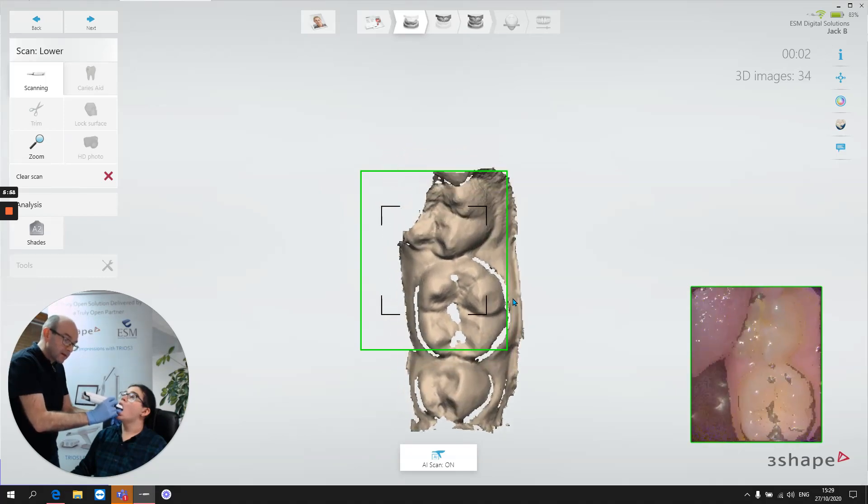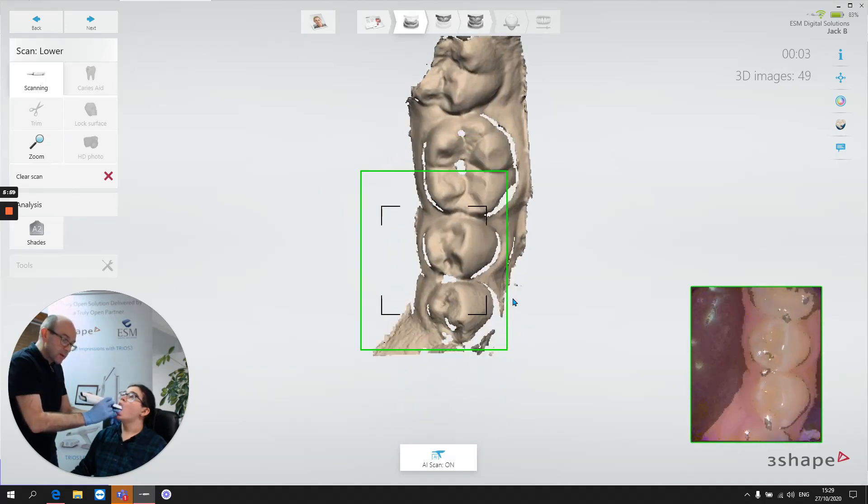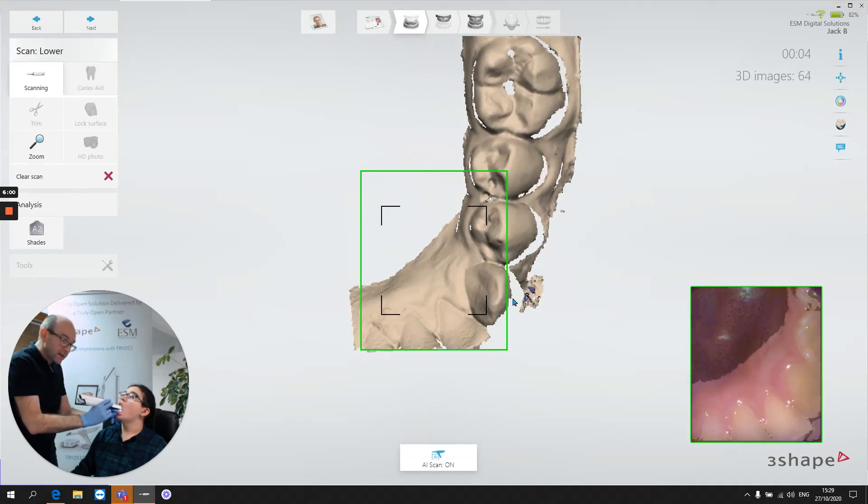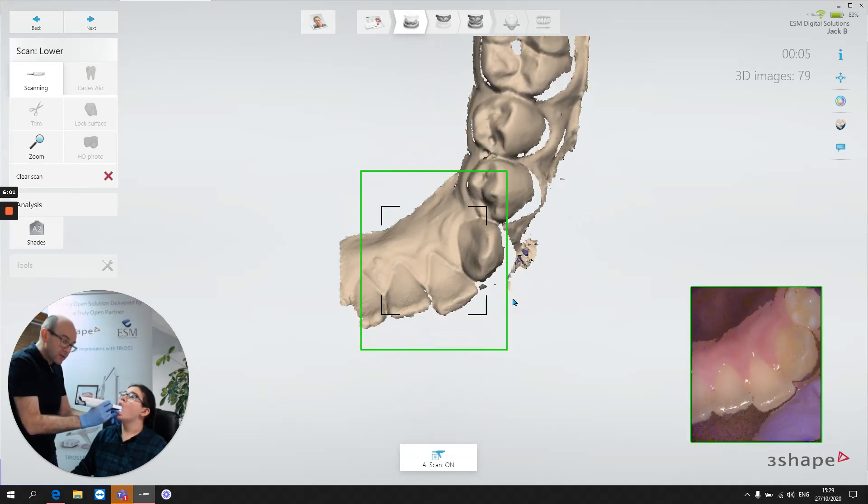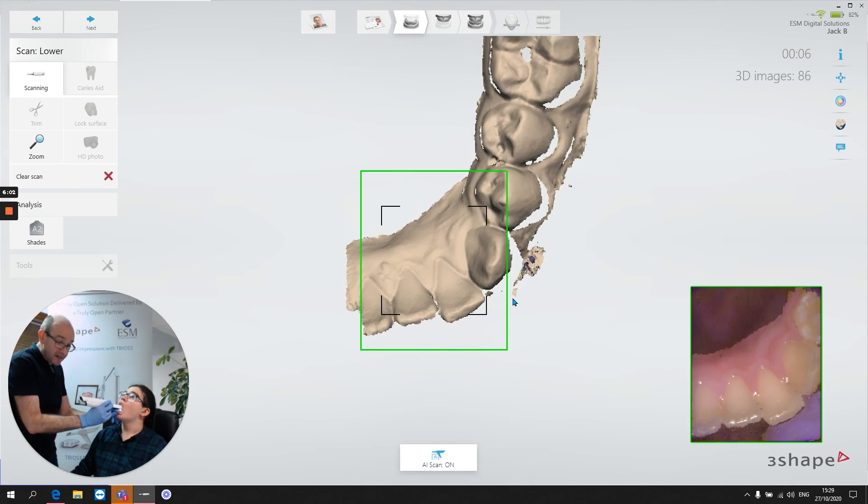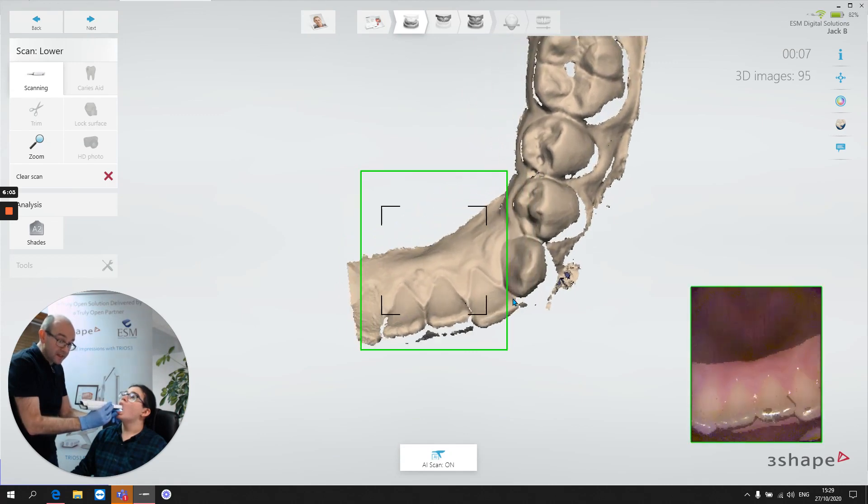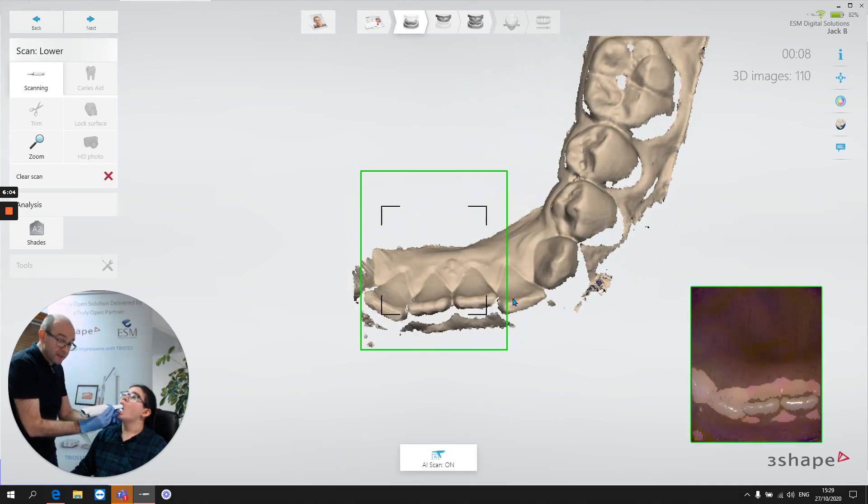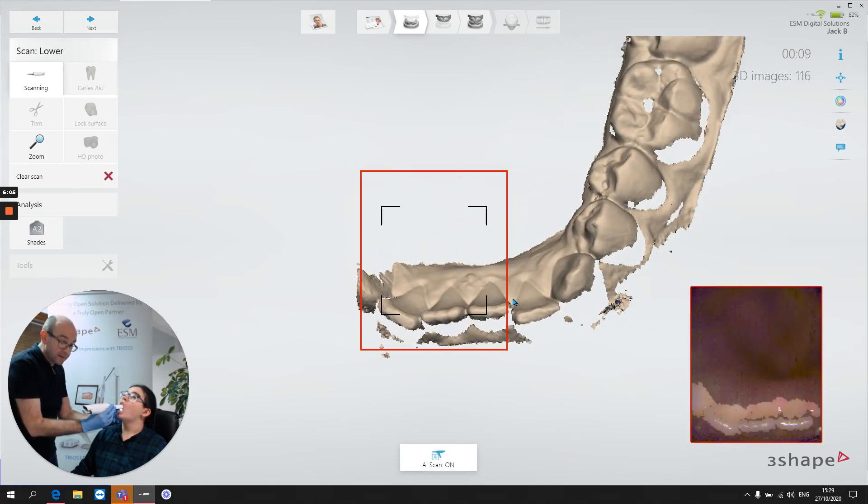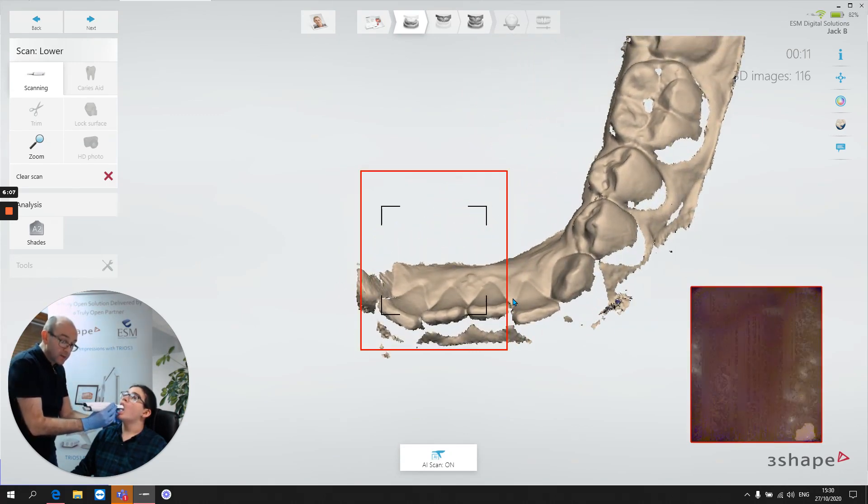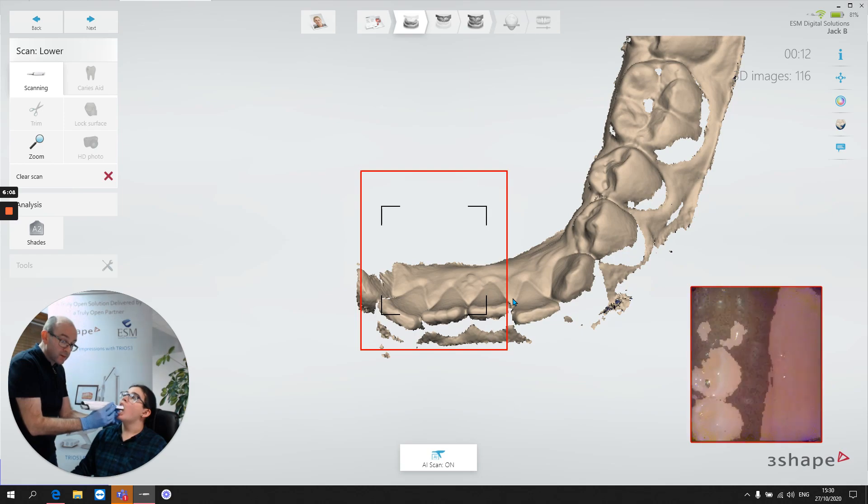Okay, so starting at the back, we sweep forward and as we get to the anterior region, you can see the scanner only sees the lingual detail. So let's rock the scanner a little bit.